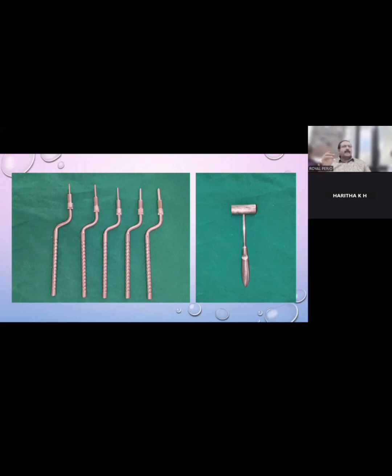Okay, now what's next? 3.2. Your implant size is 4.25, so around 1 millimeter more in diameter. So do I go and place it directly or still enlarge it with another osteotome? You have another osteotome next after this. What is that? 3.7 to 4.2. So 3.7 is there. If you want to increase the size and compress the surroundings, you can use that fourth osteotome as well. That will enlarge it to 3.7.